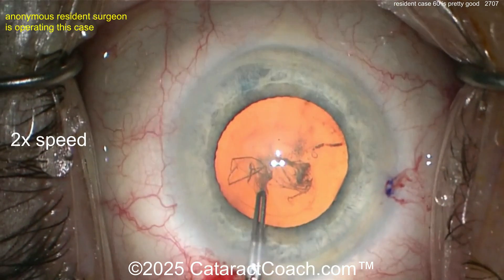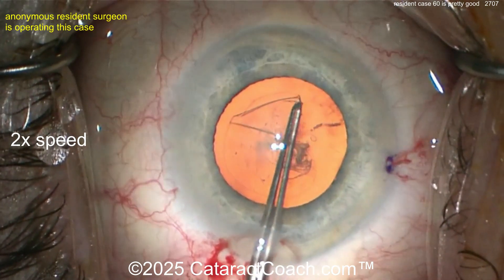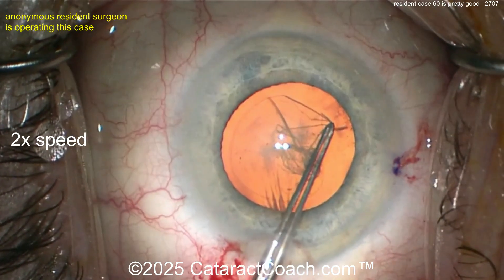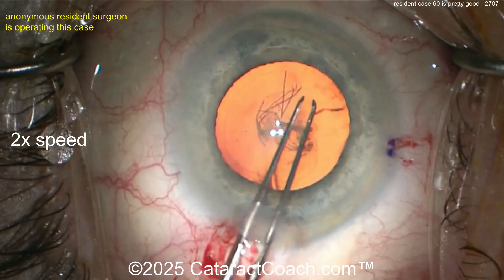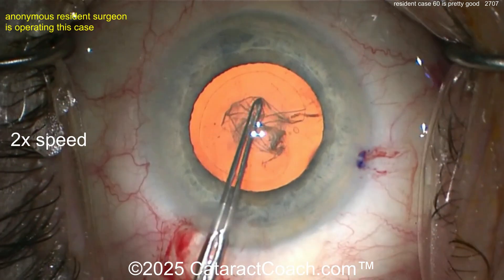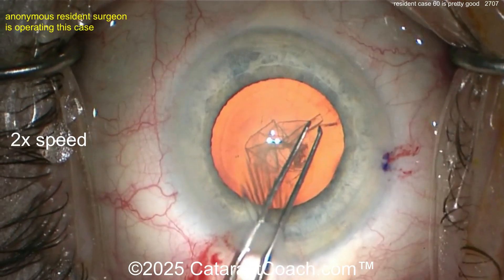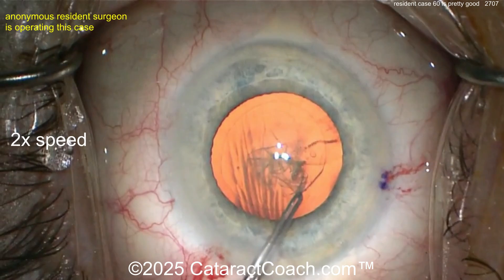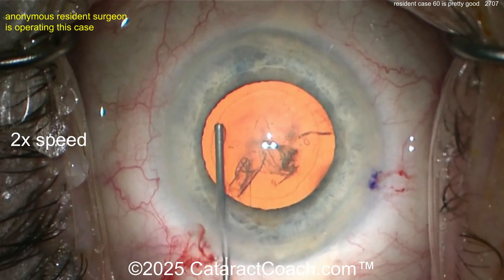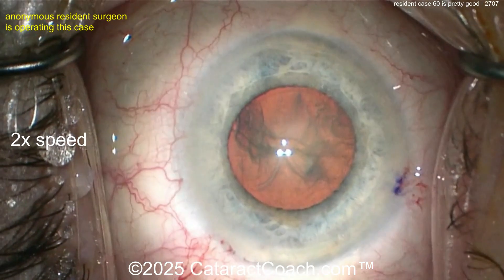Don't make a baby rhexis — that's actually a good size, I like that. Good job grabbing it, pivoting — I like the pivoting technique — and repositioning so you can have an easy grab. Bring it around. I think you're doing a great job for case 60. This is fantastic for the rhexis. By the way, I like the draping — all the eyelashes are out of the way, lid margins sequestered. The eye is in primary position and the patient is very comfortable under anesthesia, probably a block. Not bad on the rhexis at the end — you were a little bit on the smaller side, but still fantastic for case 60.